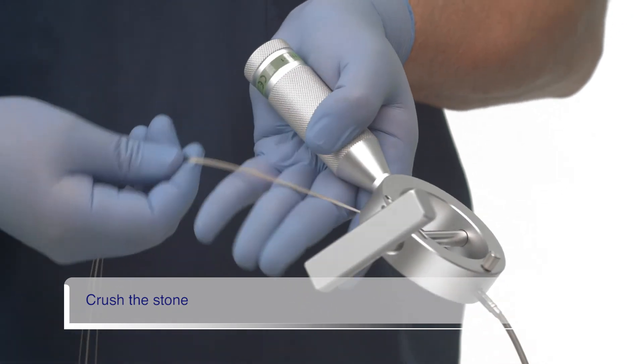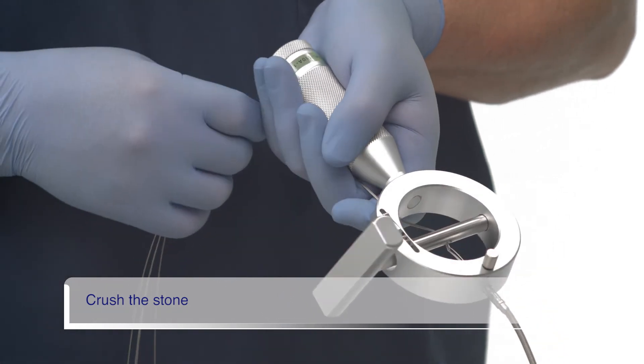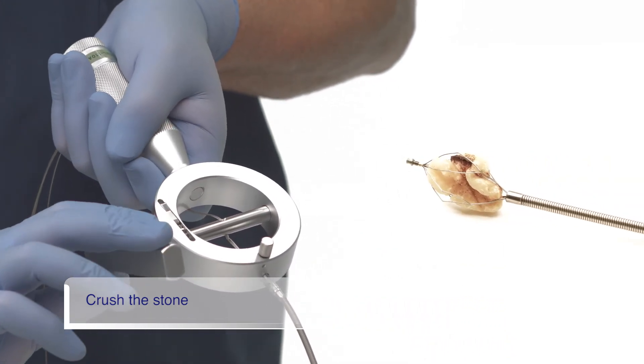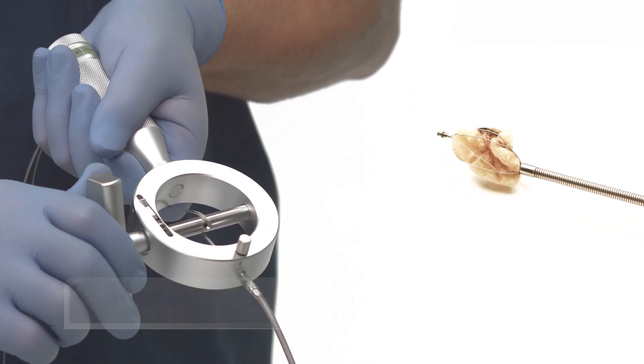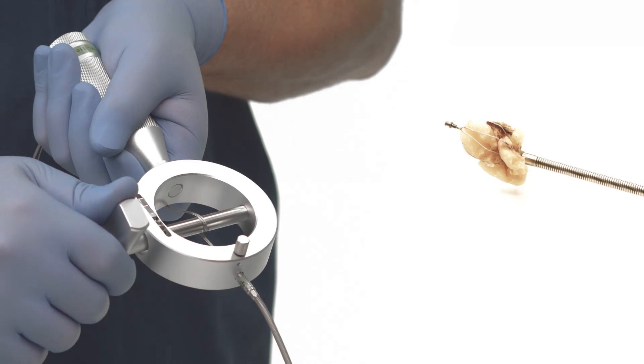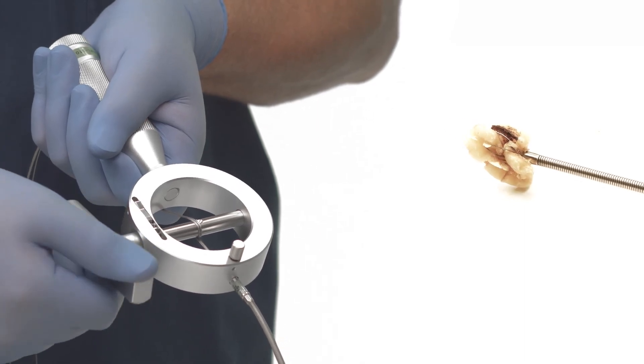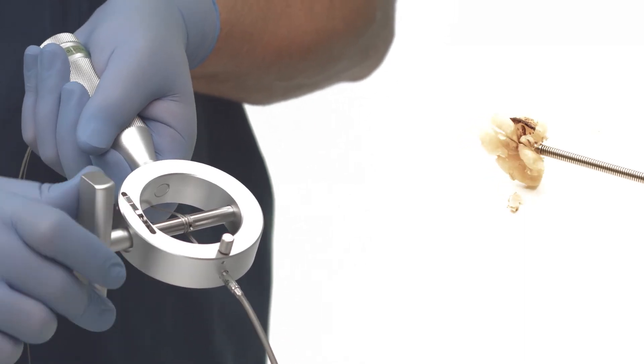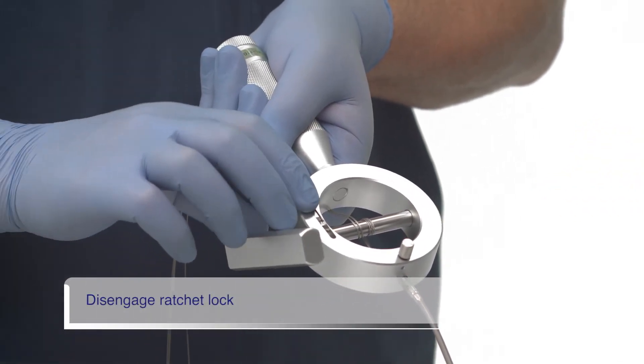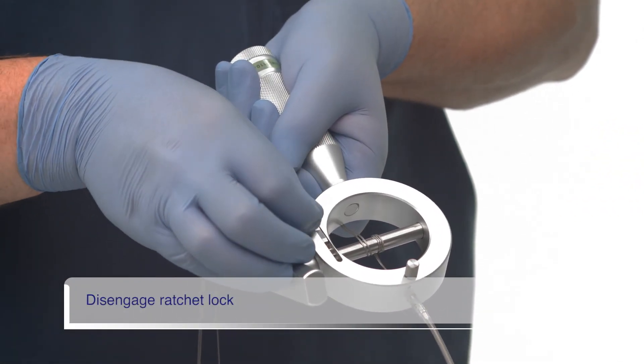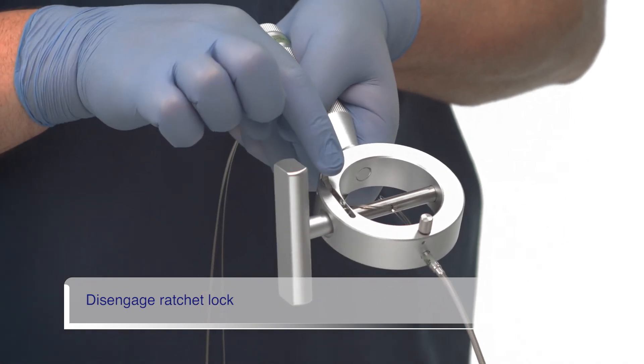While holding the wires against the handle with your left hand, slowly turn the rotatable bar with your right hand to crush the stone. Once the stone is crushed or the basket is broken, ensure that you relieve the tension in the coil sheath by disengaging the ratchet prior to removing from the patient.